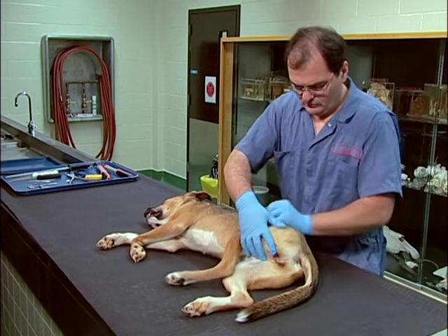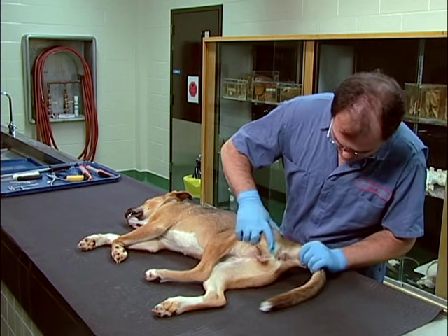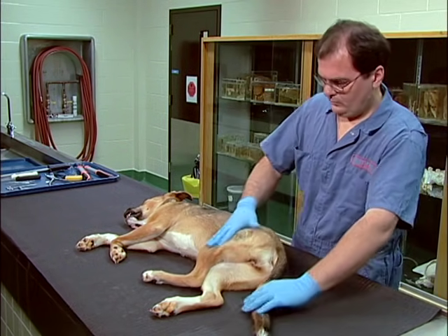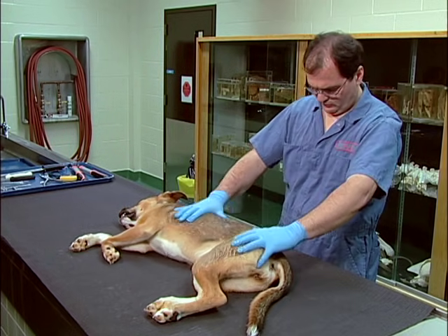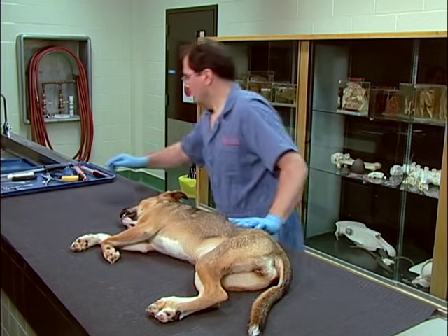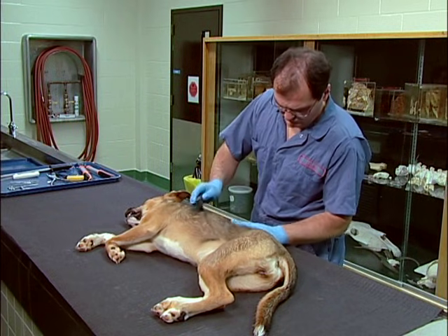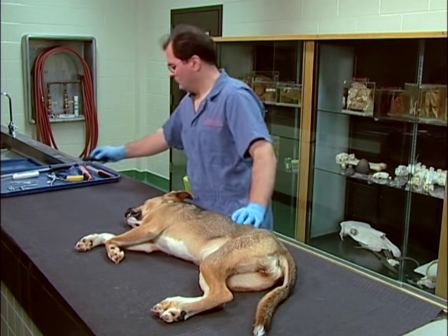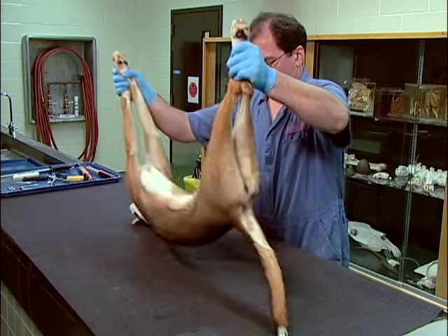Special attention is paid to the color of mucosal surfaces and presence of changes such as exudates, erosions, or vesicles, to name a few. Examine the quality of the hair coat and skin for the presence of alopecia, pustules, erosions, ectoparasites, and other changes. Also evaluate the symmetry and abundance of muscle mass.